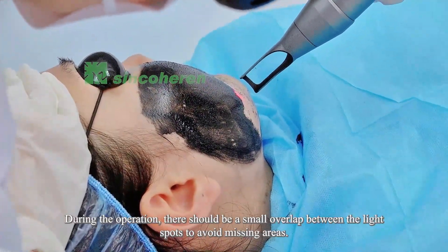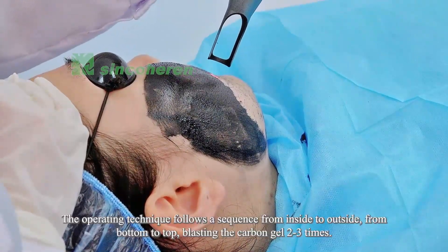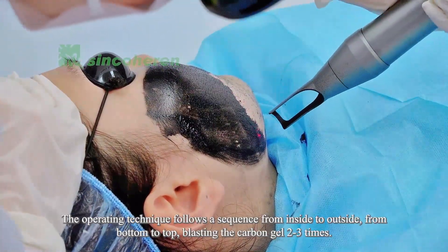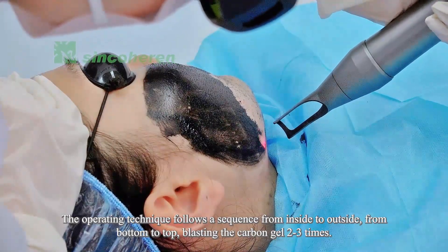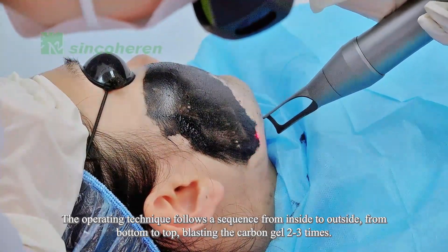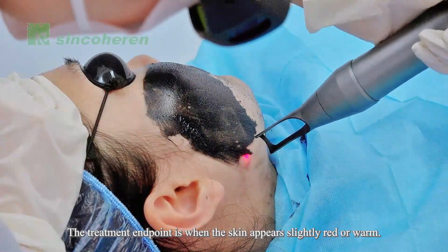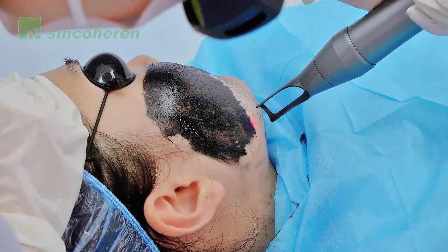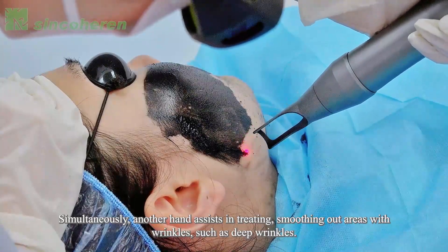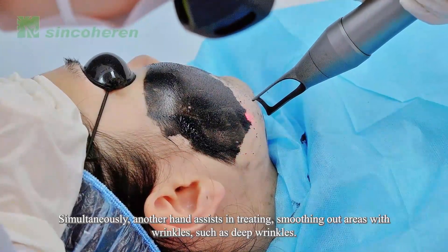The patient may feel a slight needle prick on the face during the treatment. There should be a small overlap between the light spots to avoid missing areas. The operating technique follows a sequence from inside to outside and from bottom to top, blasting the carbon gel two to three times.